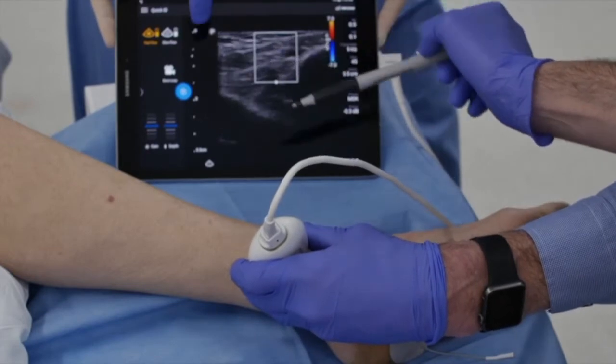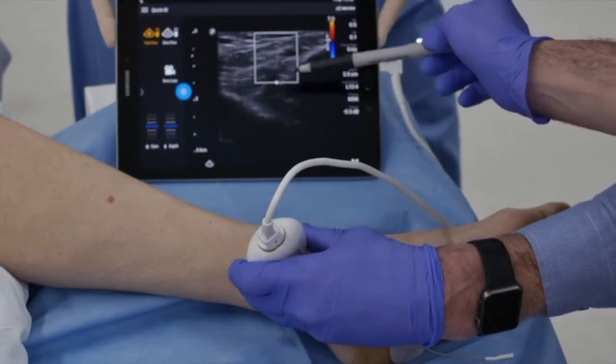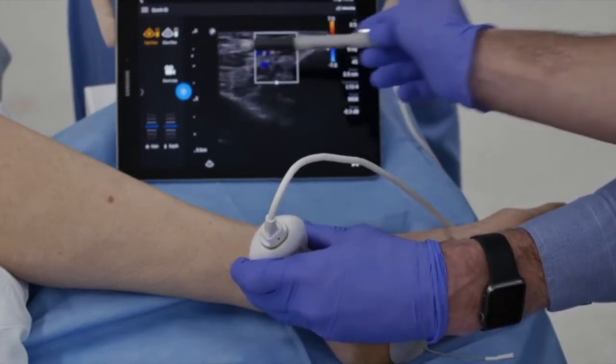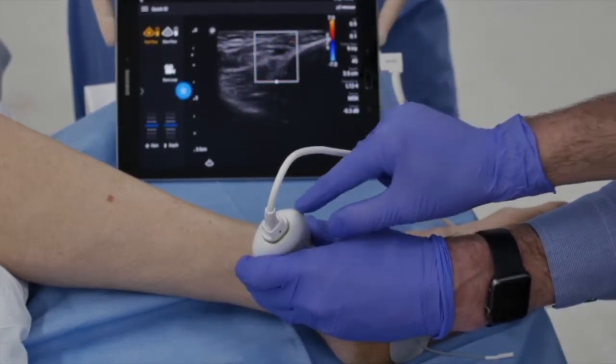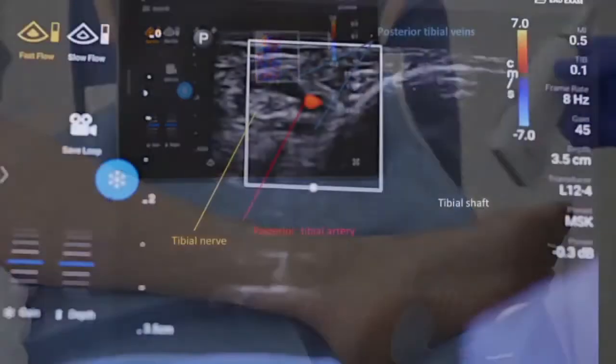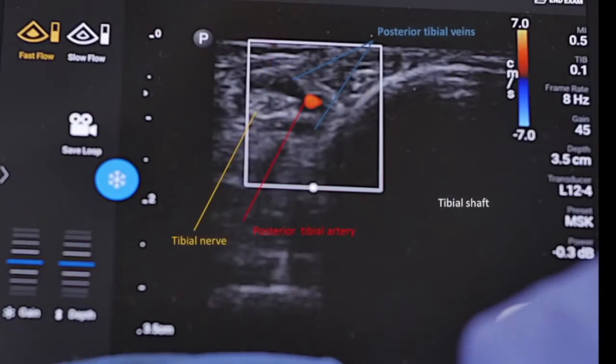An ultrasound probe is used to identify arterial, venous, and nerve structures. The center of the sound head is positioned posterior to the medial malleolus and approximately 5 cm superior. The vascular bundle surrounding the posterior tibial nerve can be visualized here. The nerve is in typical position posterior to the artery and approximately 1.5 cm deep.